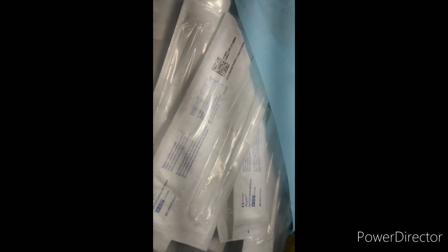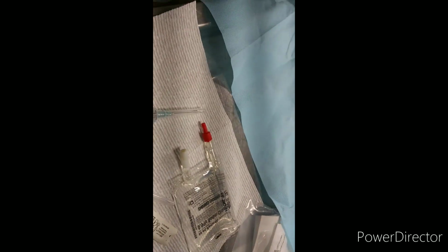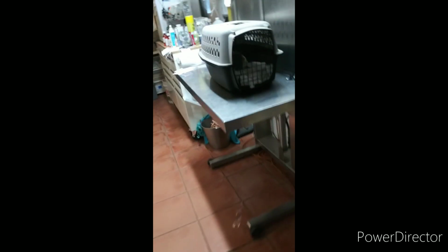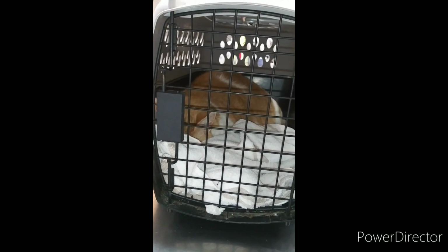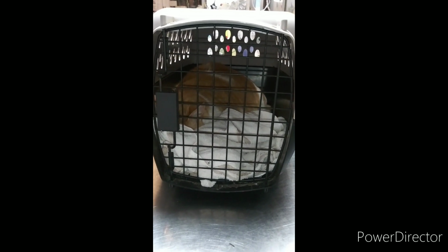So I'm going to put a 5.5 inch long, 3.5 French open end catheter in him. Of course, I'm going to suture it in place. But I'm getting set up for him, so let's go ahead and get him out of his little crate. His bladder is as big as a grapefruit.